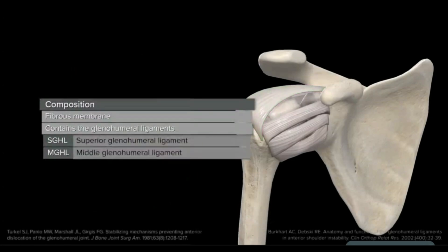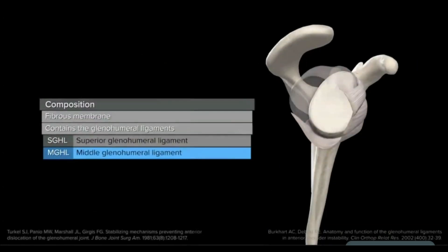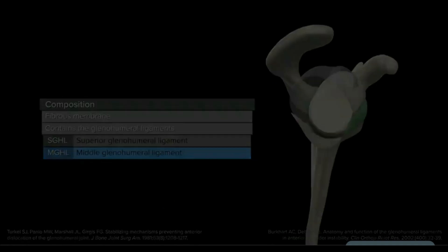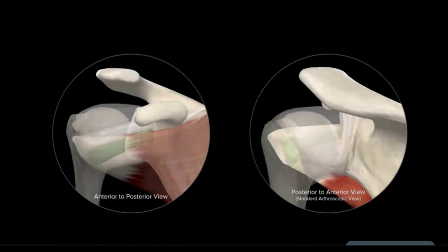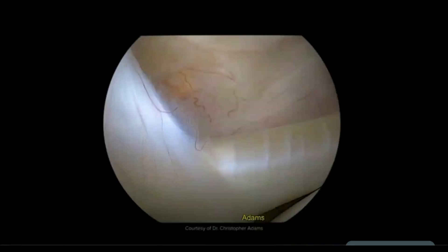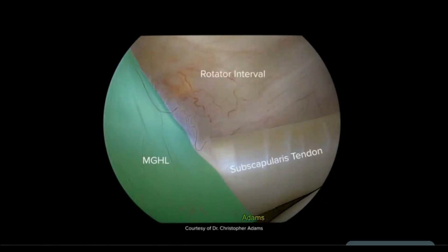Also contained within the capsule is the middle glenohumeral ligament, or MGHL. The MGHL crosses obliquely posterior to the subscapularis tendon, originating from the anterior superior surface of the labrum and glenoid neck medially. It inserts laterally onto the lesser tuberosity of the humerus. Shown here from an arthroscopic posterior viewing portal, the MGHL is situated posterior to the subscapularis tendon — note the oblique orientation.